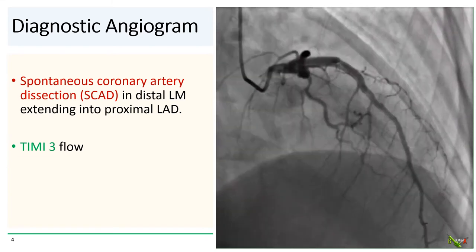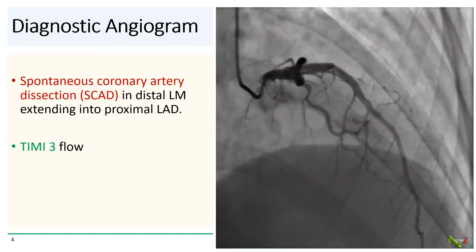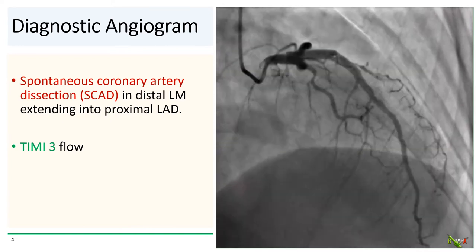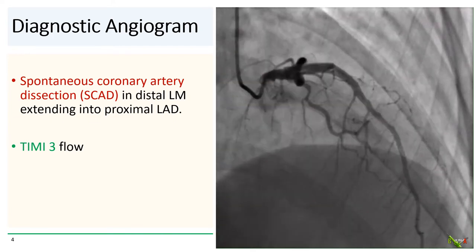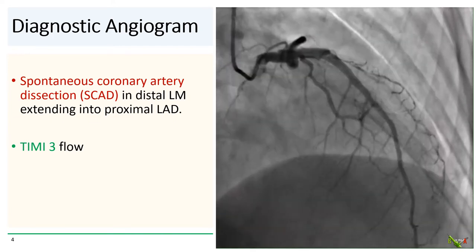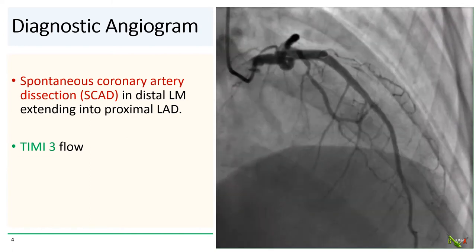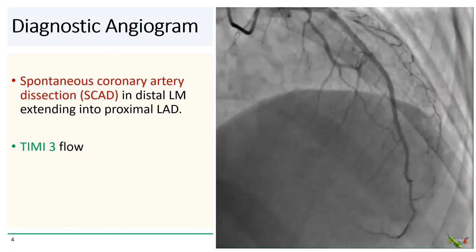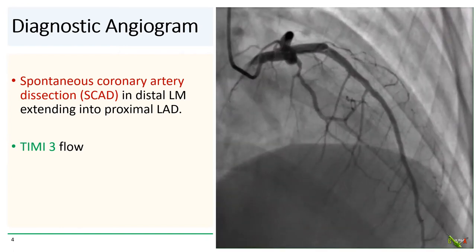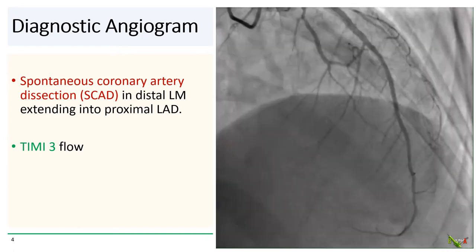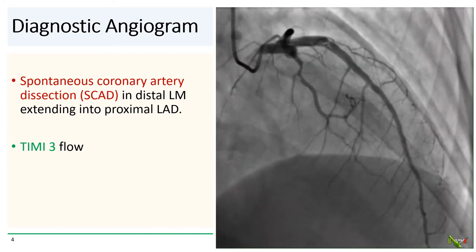Most of the time, it is actually quite difficult to differentiate the true lumen from the false lumen. In this case, however, it seems pretty clear that the true lumen is inferior to the white line and the false lumen is the uplifted section above the white line. This is a fairly dramatic example of a type 1 spontaneous coronary artery dissection that extends from the distal left main into the proximal LAD.